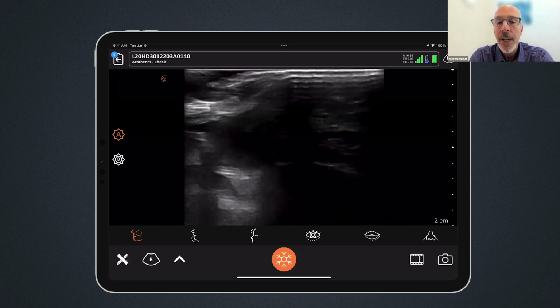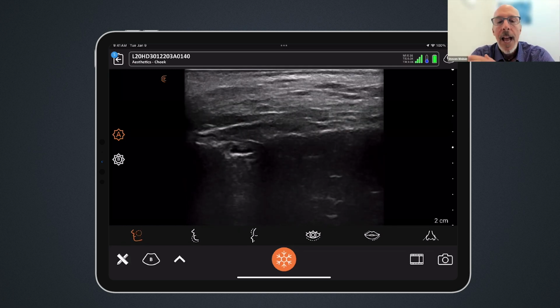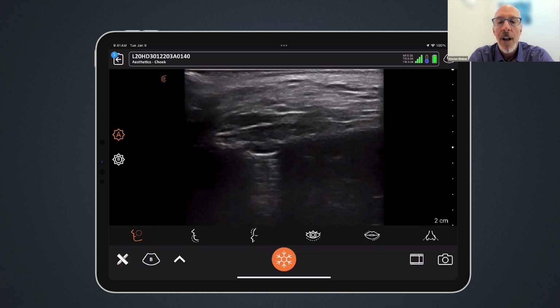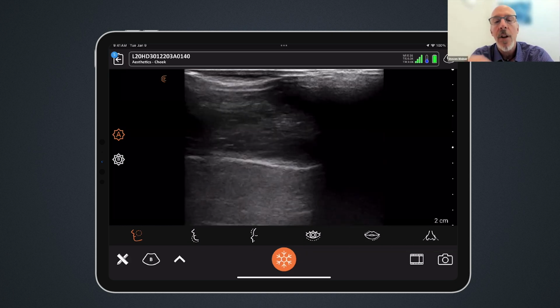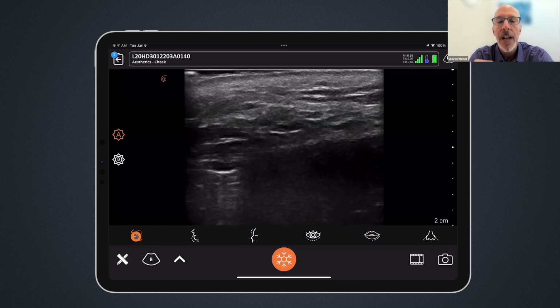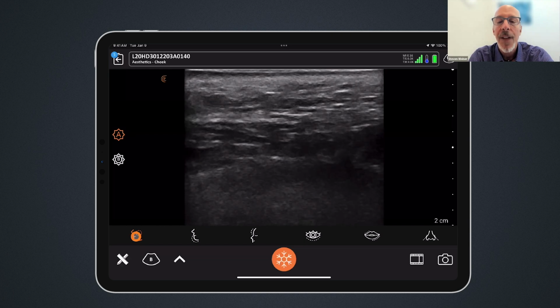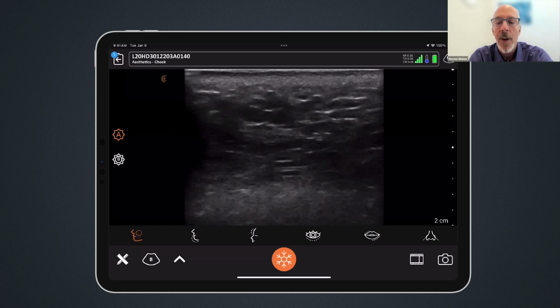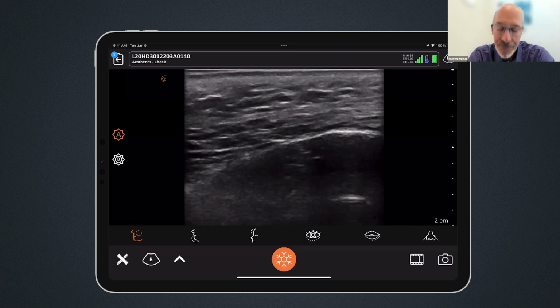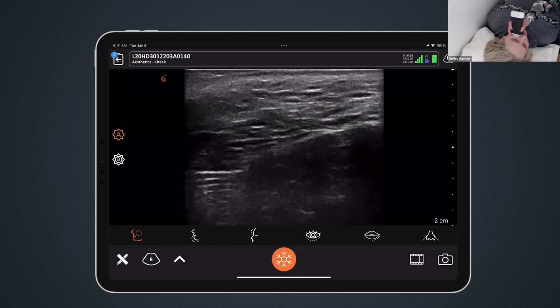So in this particular area, you need to overgain it, and that will bring out the very small vessels, because what happened is it looked all clear. I went down to the bone and did an aspiration and found blood in the needle. And then when I went back, I found out that I had missed a small vessel. So overgain it there. Yeah. Safety. Err on the side of caution.